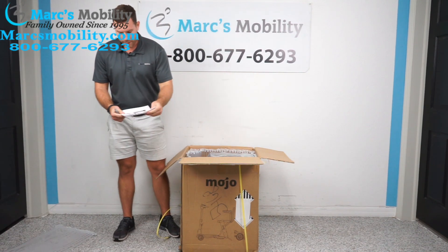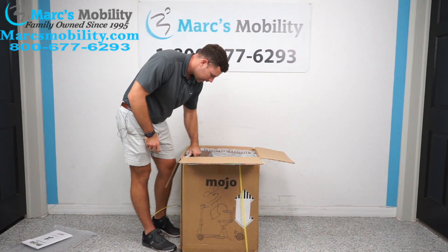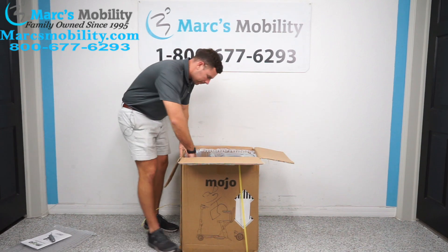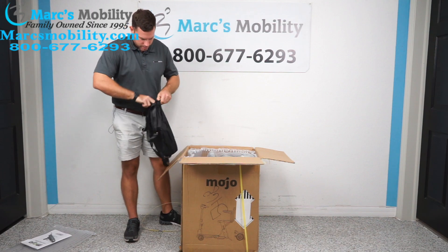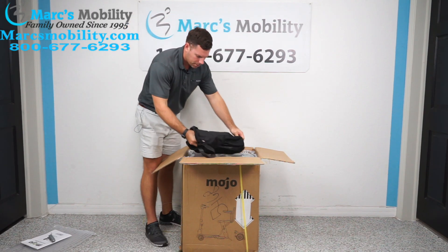You will have your owner's manual sitting right up top. It does look like it comes with a bag, and inside this bag is probably your charger and other equipment.